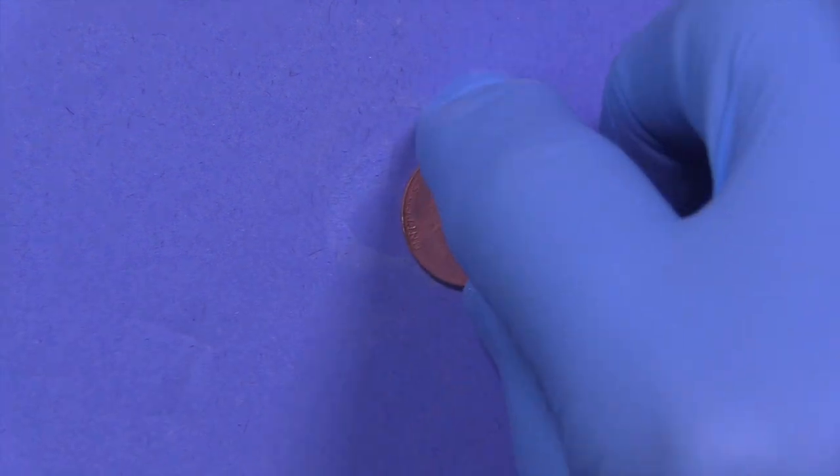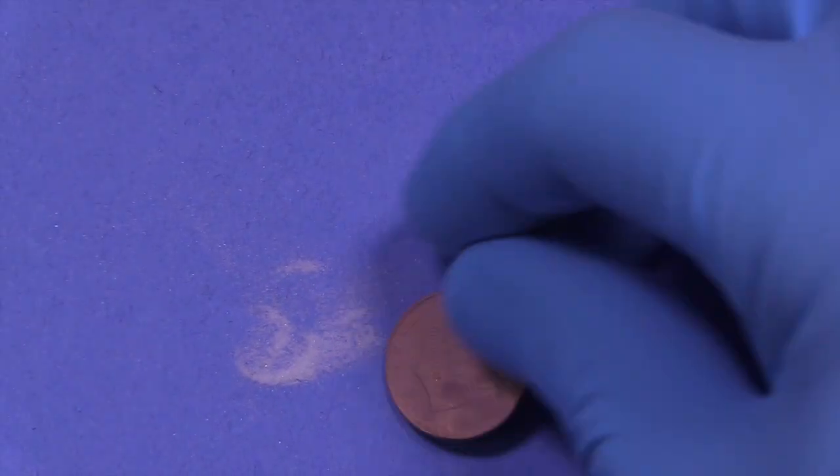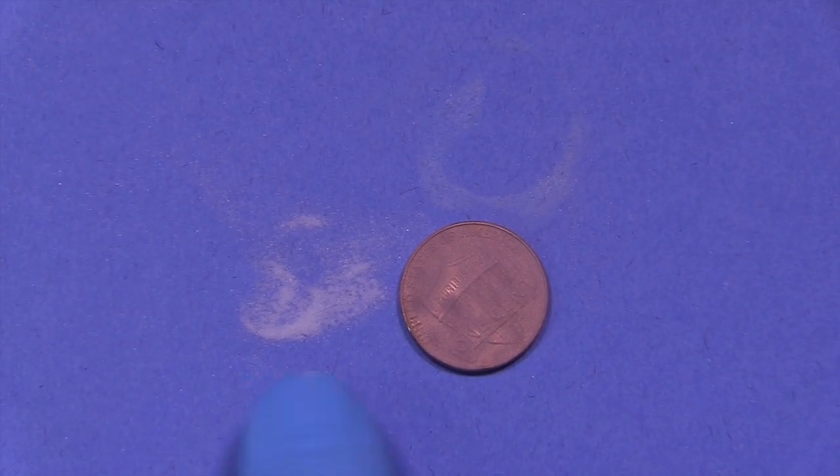What's kind of cool about this is that there's just not a lot of debris. I'm scraping up the material to show you that there's very little material wasted or that would get all over the patient. Pretty simple.